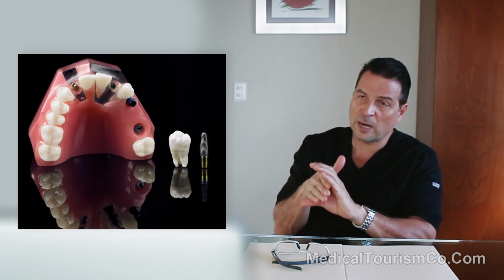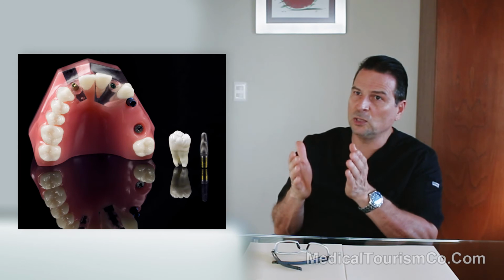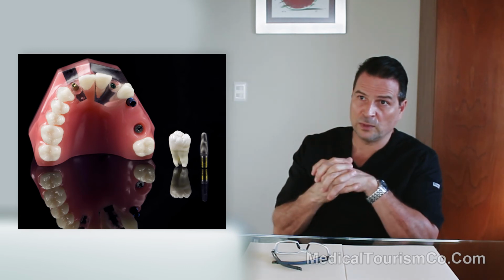And for single implants, for example, in the anterior segment, we always do immediate loading when it's possible. But we need to assess and make sure that the patient is a candidate for that with a CT scan. If the patient is a candidate, the best way to preserve those tissues is to do an immediate load because once you place the implant at the time of the extraction, you will create a temporary that will have the form of a tooth. And this will help to preserve the tissues, both the bony and the soft tissue, in a perfect way. That will enhance the aesthetics, of course, of this restoration.